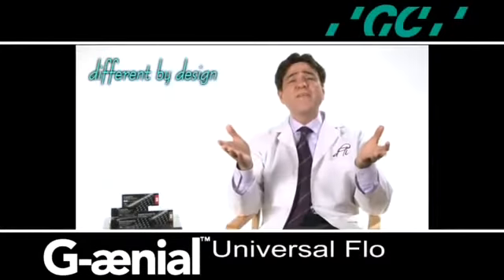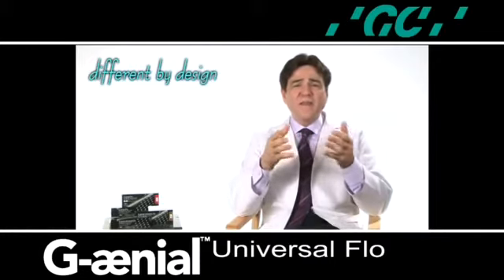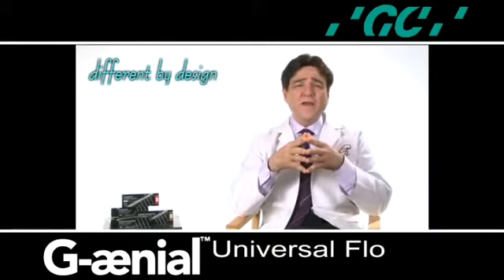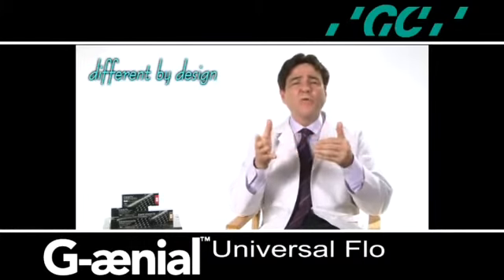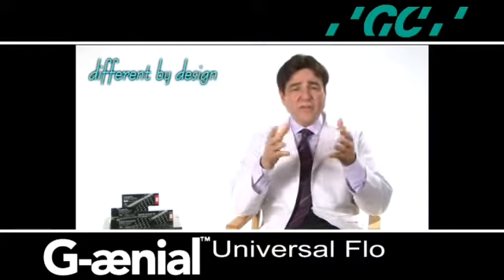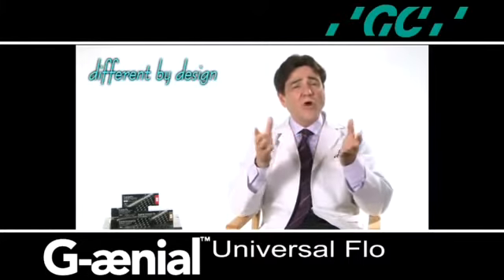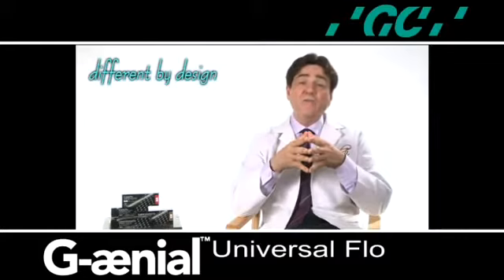Today, improvements in resin chemistry technology, optimization of material properties, and the development of innovative techniques for placement have made composite resin more user-friendly and reliable. Until recently, the flowables were clinically indicated and acceptable as filling materials in low-stress applications such as cavity liners, sealants, preventative resin restorations, small Class 1 restorations, Class 2 substructure, small Class 3 restorations, and Class 5 restorations.